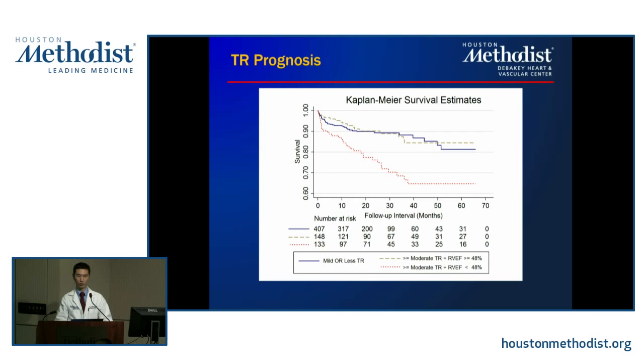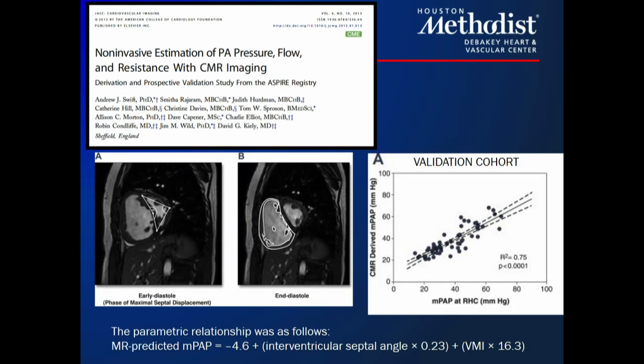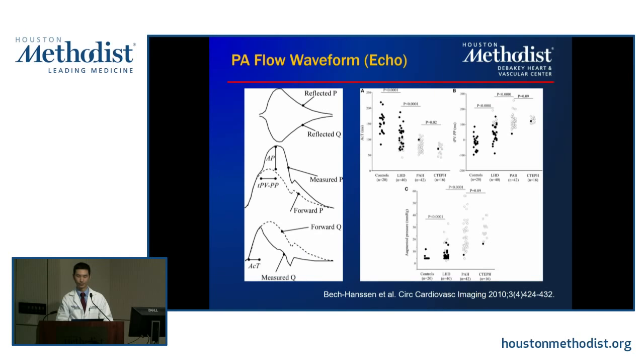Okay. One thing that we often observe is also the geometry, and some people have looked at whether or not this allows us to infer mean pulmonary pressure as well, although this isn't widely applied. But this is a potential option, not only in the CMR world, but in other modalities where you can see the angle with different cardiac phases. Okay.